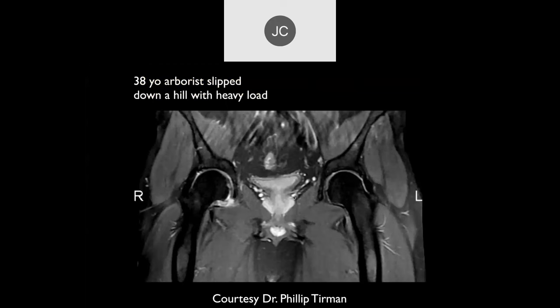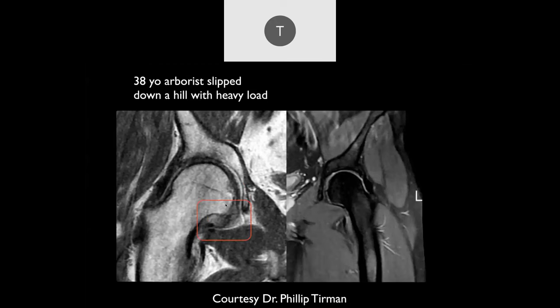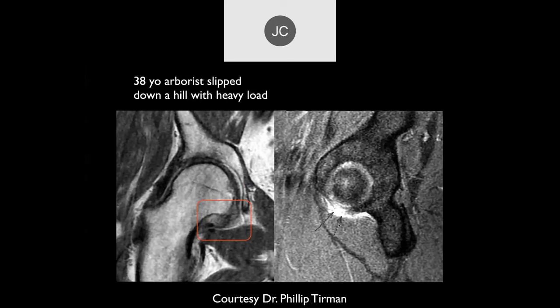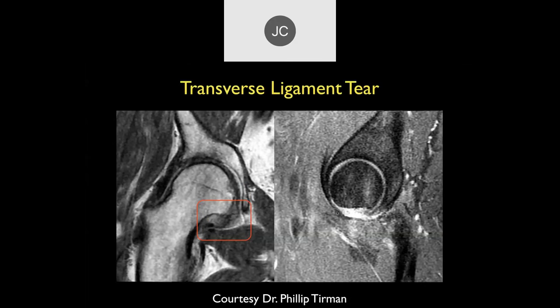Patient slipped down a hill with a heavy load. There's edema inferior to the femoral head. This appears to be a transverse ligament tear — here we can see it, and the edema within it on the sagittal PD fat sat. There's the tear of the transverse ligament.